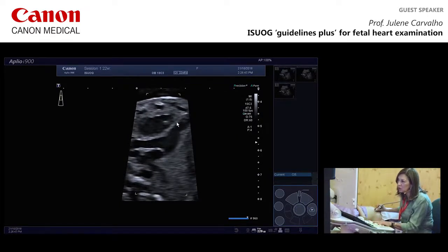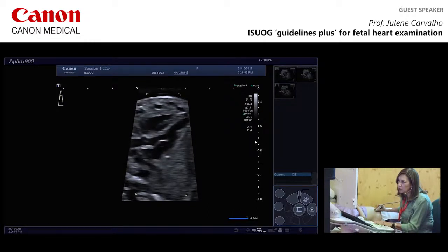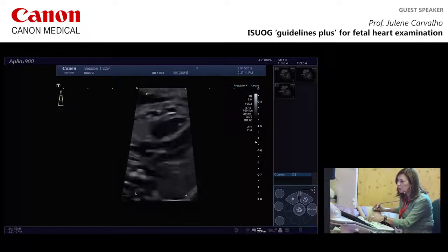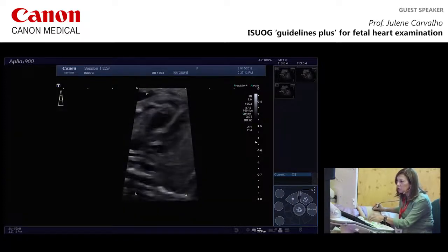Nice continuity here between the left ventricle and the anterior wall of the aorta, until the aortic valve appears in there, and then it's going to open, and then it's going to close. I'm moving back. You can see the mitral valve open and closing as well. And you see the hinge points of the aortic valve, not quite as clear as I'd like to see it, so I'm going to put a bit more pressure here.